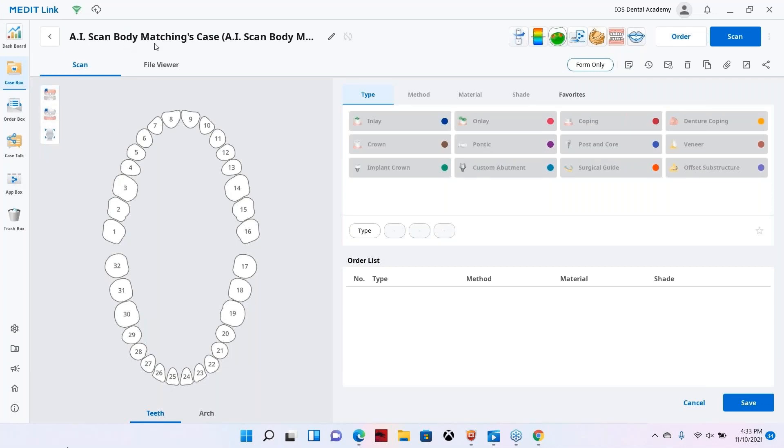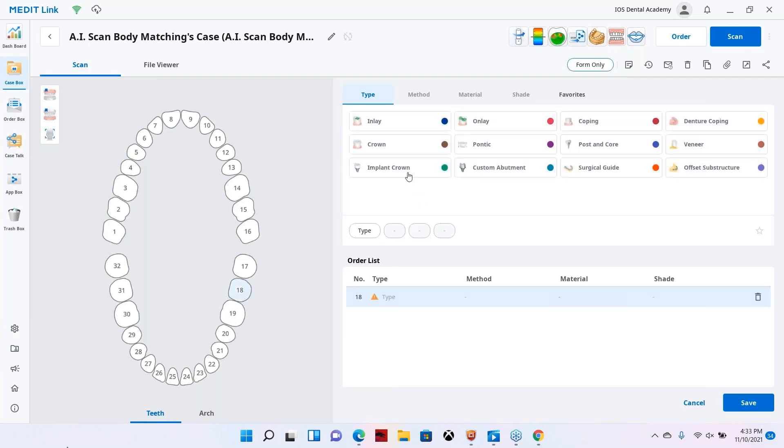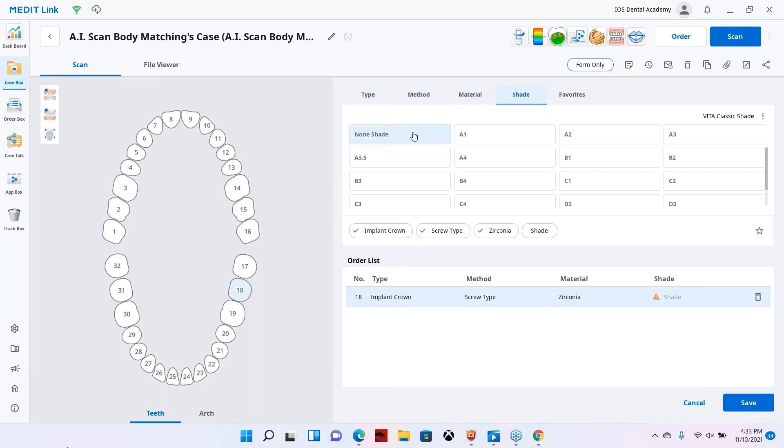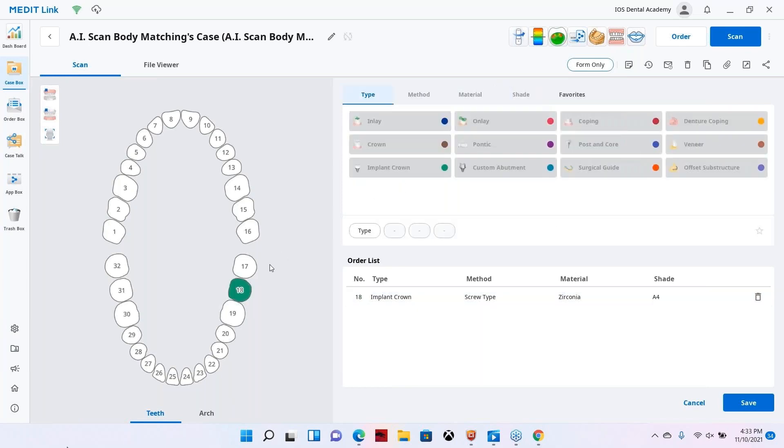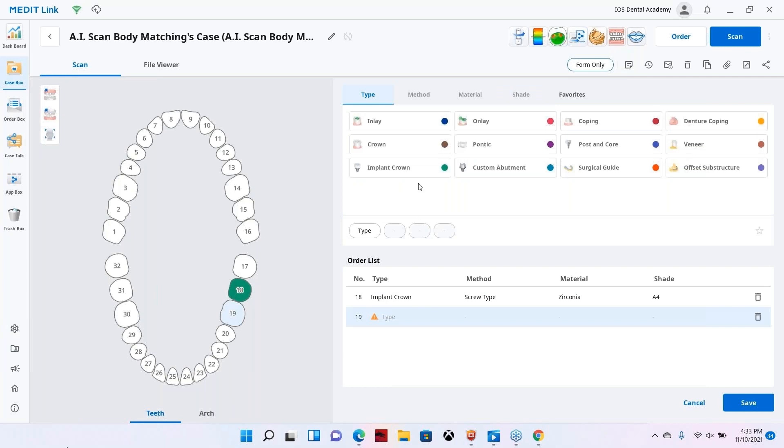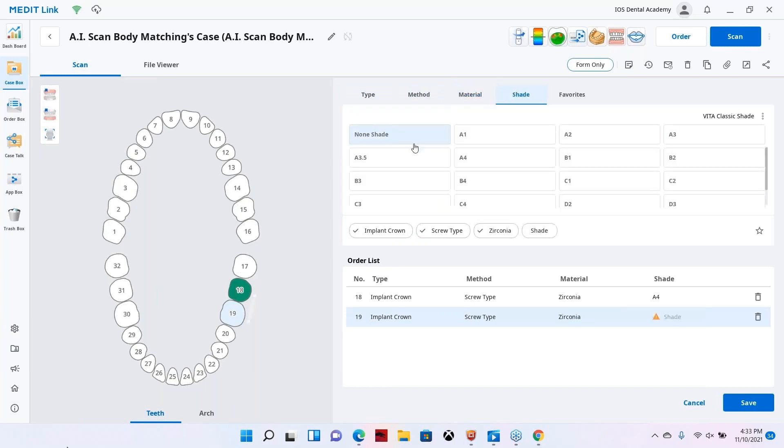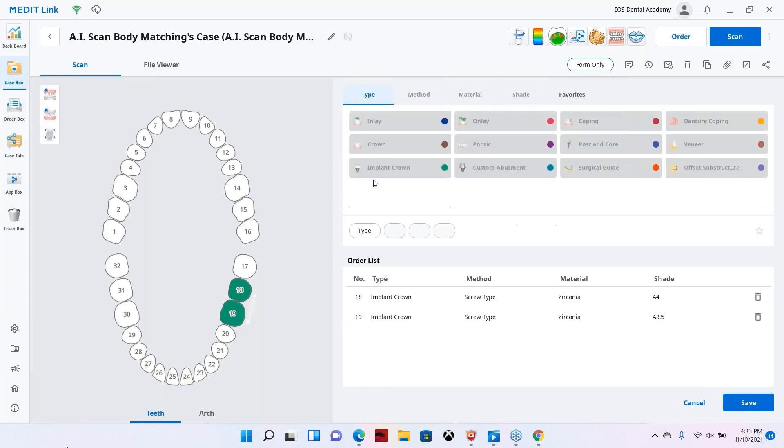Now I want to show you what the updated AI scan body matching software looks like. What we're going to do here is select the tooth first. We're going to select an implant crown, screw retained, and zirconia. And let's now pick the shade, we'll go with A4 here. Let's go ahead and select tooth number 19 now. We're going to go with implant crown again, screw retained and zirconia. And let's pick a different shade, A3.5.